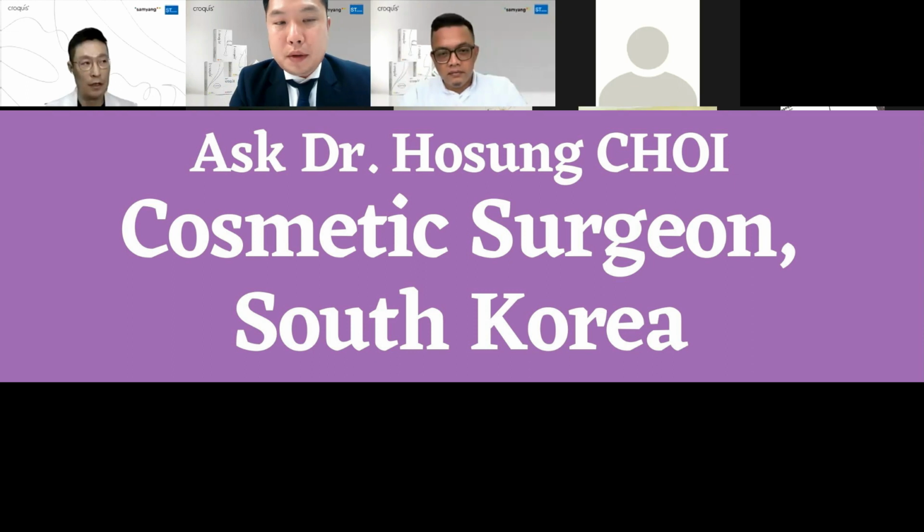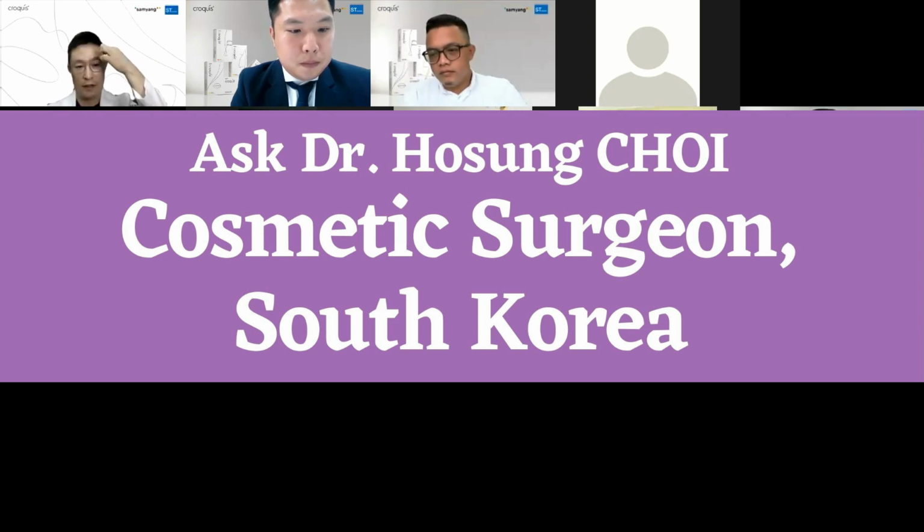Yes. If you want a more concentrated lifting for a focal area to make a foxy eye lift, then I recommend putting more threads on the lateral part. If you put one thread per 1 centimeter space, then put 2 or 3 threads to provide a stronger lifting effect.